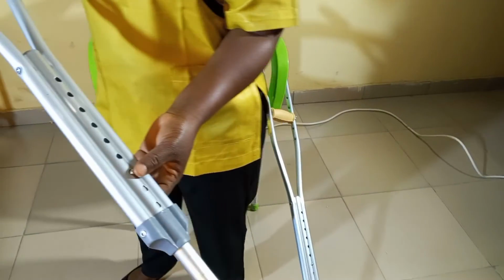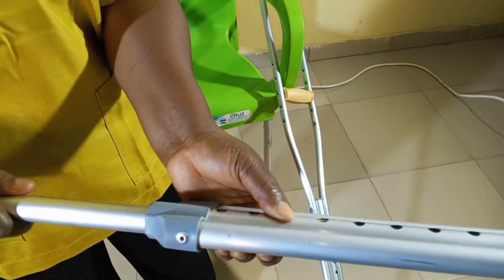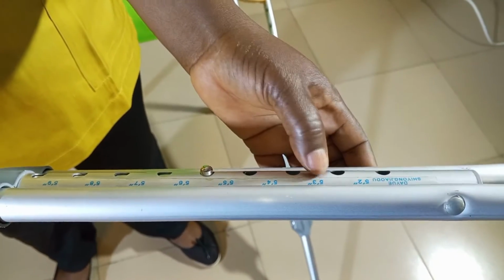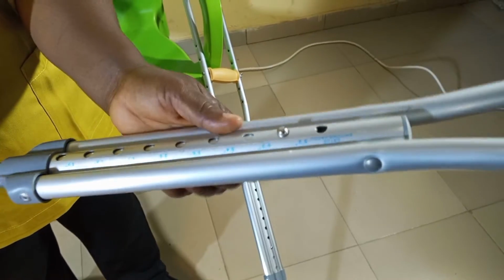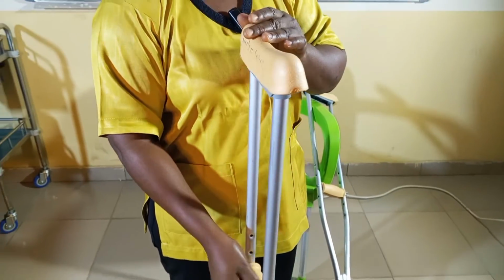When adjusting the crutches to the patient's height, you have to press this button, and then push it inside. You keep pressing and keep adjusting. So remember, the crutches have numbers. They are numbered in feet and inches, 5.3, 5.2, 5.4. So you keep adjusting. If the patient is short like me, then you adjust it to the last. The height of the crutches will be prescribed by the doctor, so that you can follow according to the patient's height.